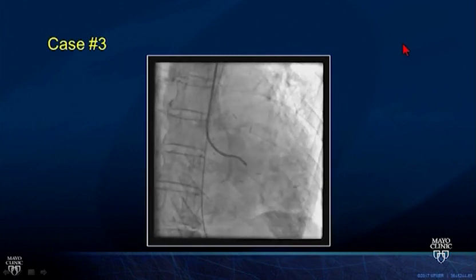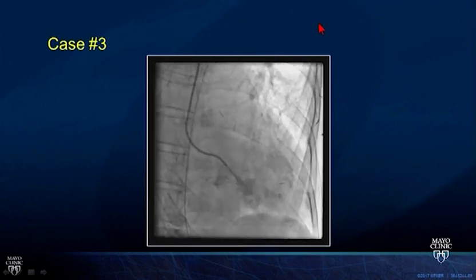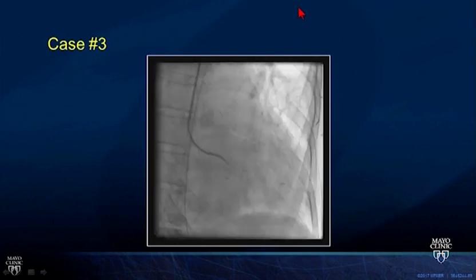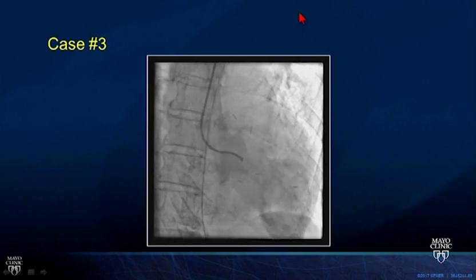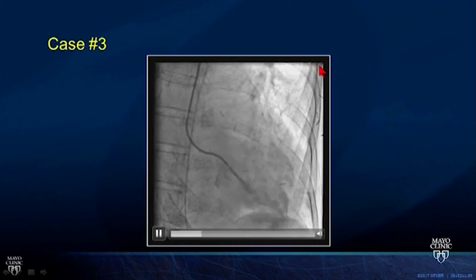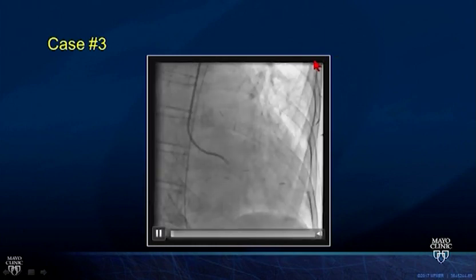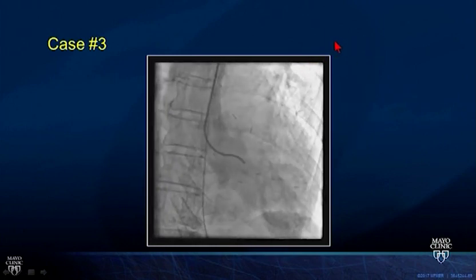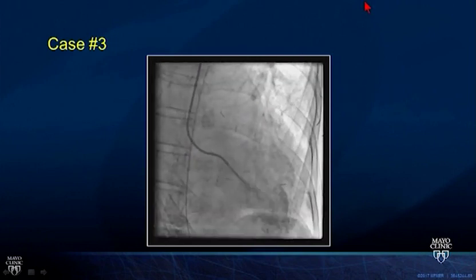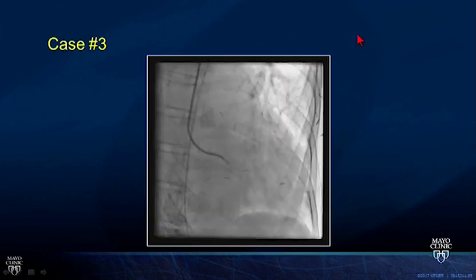Here's an unusual detection of pathology here. This is a patient, an elderly woman, presenting with an inferior ST elevation myocardial infarction and acute onset severe chest pain, but the right coronary could not be adequately engaged. Does anyone know the diagnosis? You want to call it out? Good, yeah. So several of you have already diagnosed it. That's pretty fast. So dissection, you see this huge flap in the ascending aorta going back and forth. And that dissection probably resulted in occlusion of the ostium of the right coronary and the inferior STEMI.